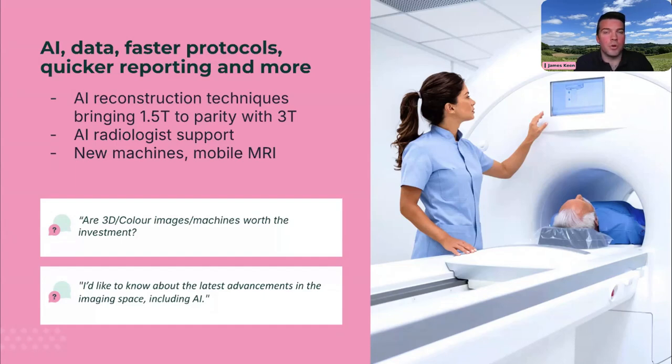But you're acquiring data at such density that you can recreate that tissue in any plane you want by way of post-processing. That can be very useful, and it's not noticeably more time consuming these days than typical slices. So 3D techniques in MR are really common.